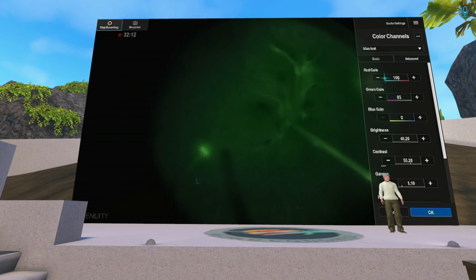I want to say that we already do this as a routine in our cases where the surgeon, in that case me, feels that there will be a benefit from intraop angio. I just ask my anesthesiologist to prepare the fluorescein and to administer the fluorescein when we are ready with the endoillumination, and it's a flip of a button on the Ingenuity.